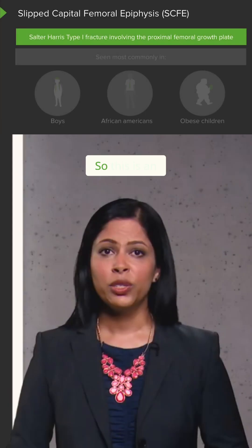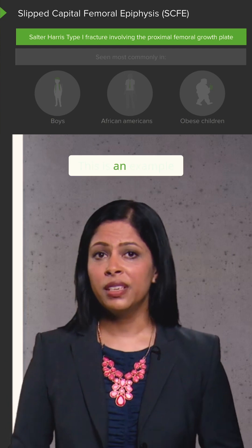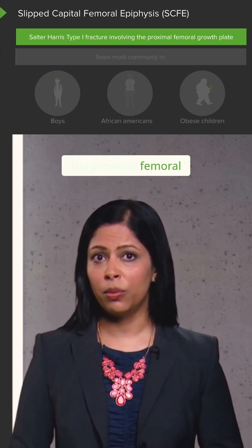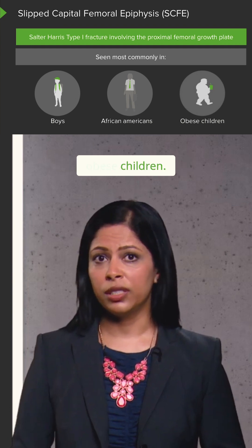So what's the abnormality here? This is an example of what's called slipped capital femoral epiphysis, or SCFE, S-C-F-E. This is an example of a Salter-Harris type 1 fracture that involves the proximal femoral growth plate, and it's seen most commonly in boys that are African-American and also commonly seen in obese children.